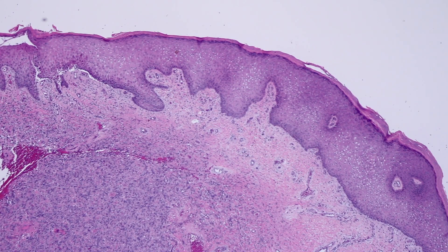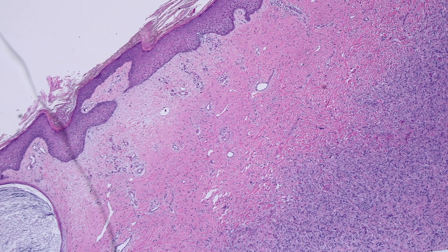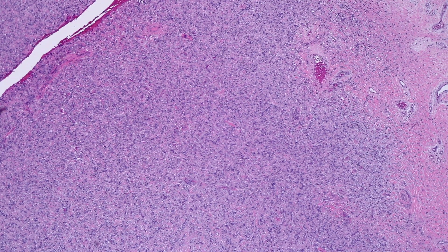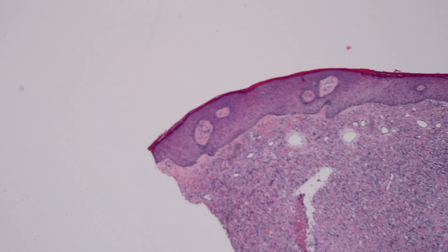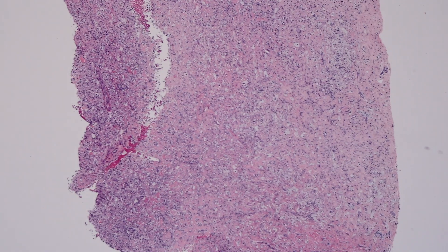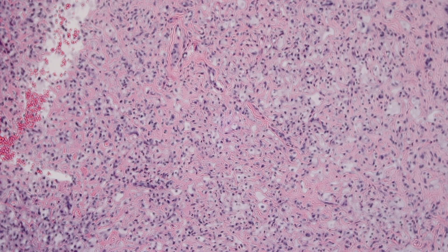The clue is the presence of dense pink collagen, which tells you you're dealing with a lipidized DF rather than a true xanthoma. Going to low power you'll see epidermal hyperplasia, tabling, and areas of collagen entrapment at the periphery. Oftentimes you'll also see foci of hemorrhage and hemosiderin deposition in these big ankle-type Dermatofibromas. Here's one other example of an ankle-type Dermatofibroma - you can see again the epidermis is acanthotic with blunting at the bottom.